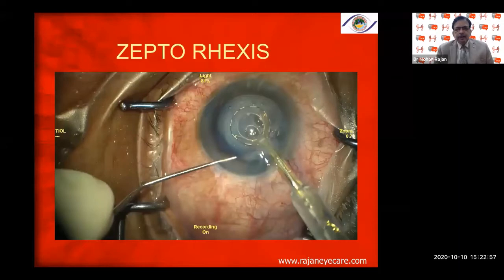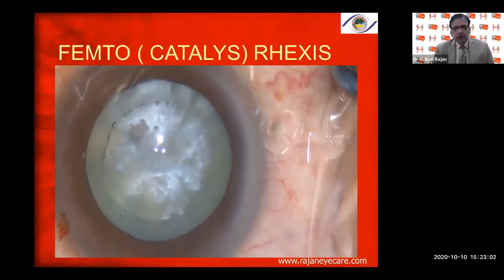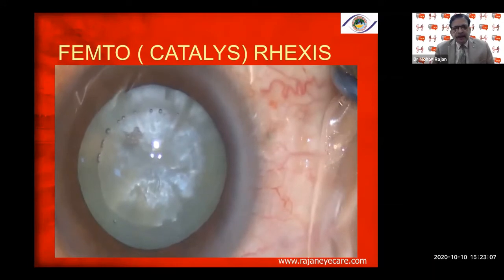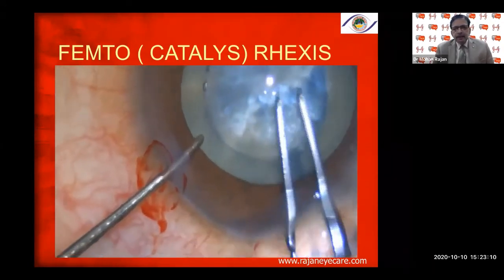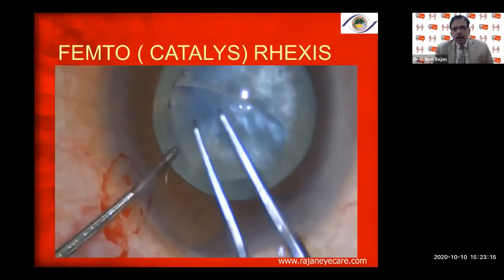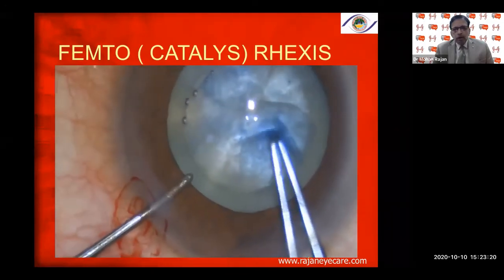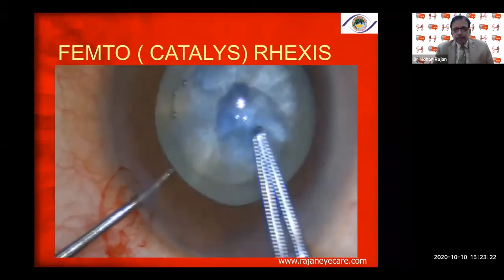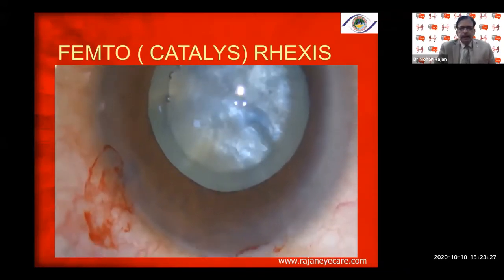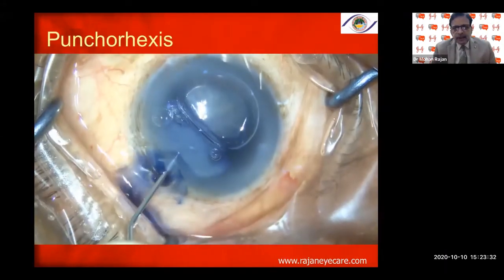Without any problems in mature cataracts, or if you have access to femtosecond cataract laser — which we have — it makes life easy in patients with intumescent cataracts. With the Catalyst rhexis, even then, look for skipped areas, but almost all the time you'll get a good free-floating rhexis in intumescent cataracts.